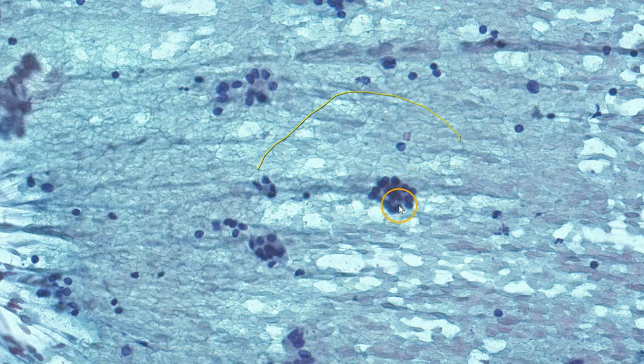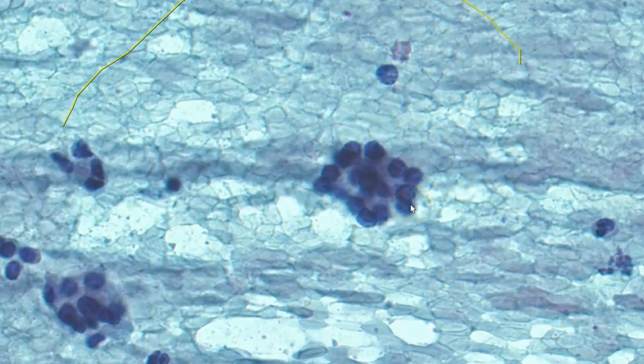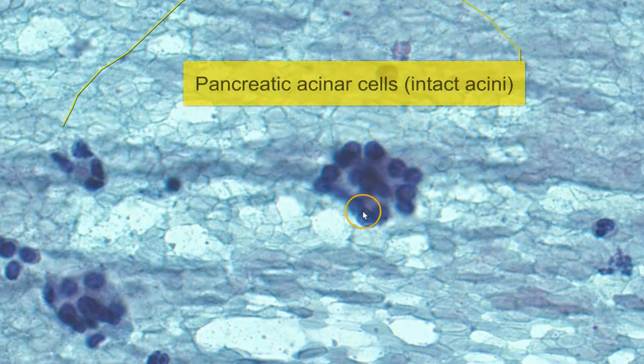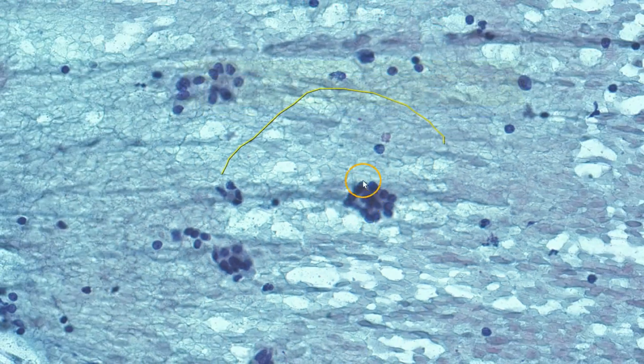These very small uniform cells with eccentric round nuclei, arranged in small acinar patterns, actually represent pancreatic acinar cells. We can sometimes see them in little isolated rounded groups, or sometimes in large tissue fragments embedded within the stroma.